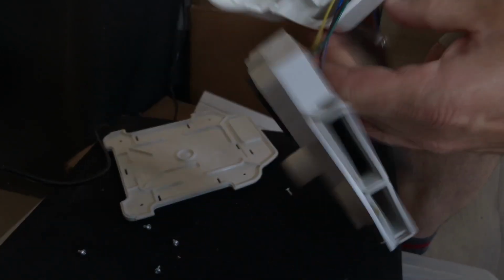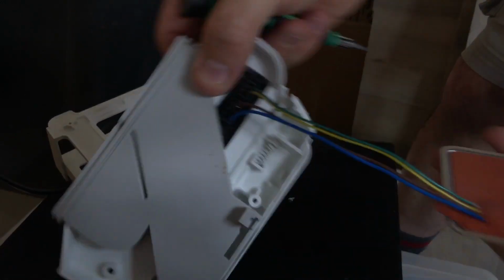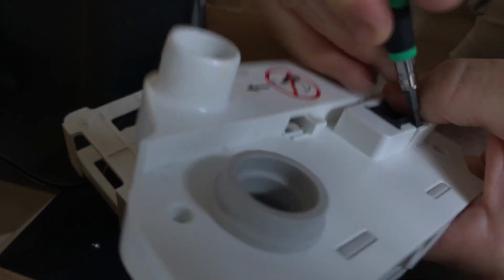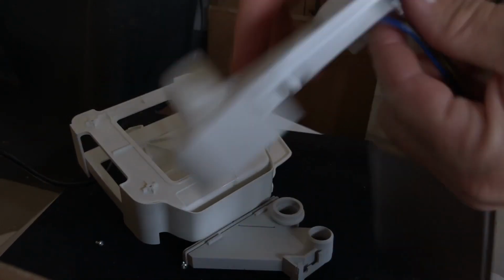All right, here we go. Almost got the wire out. Yeah. There. And now you can see why this is cut out like this. It allows this component to slide through. Okay, so that's the heating pad, and there's the port, which should also pop out with this tab opening. Should be able to get this through. Maybe. This is just a pass through for the air.